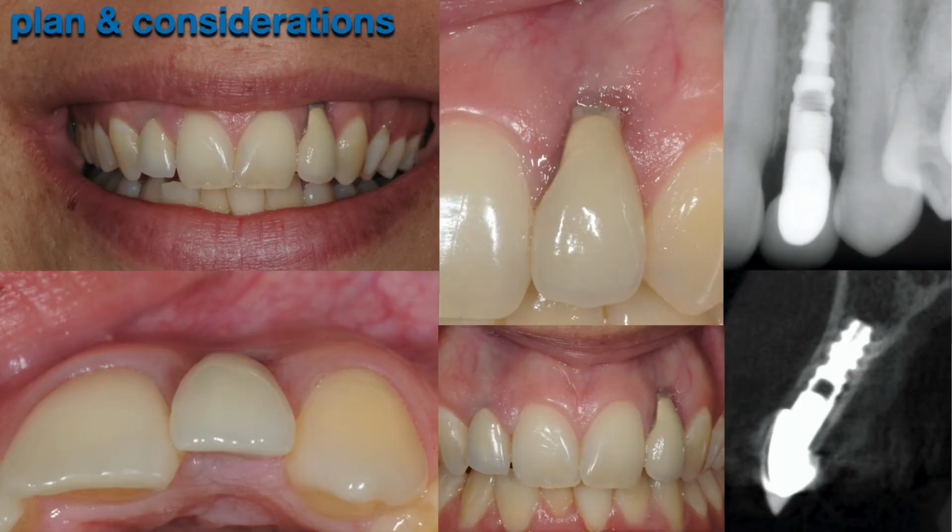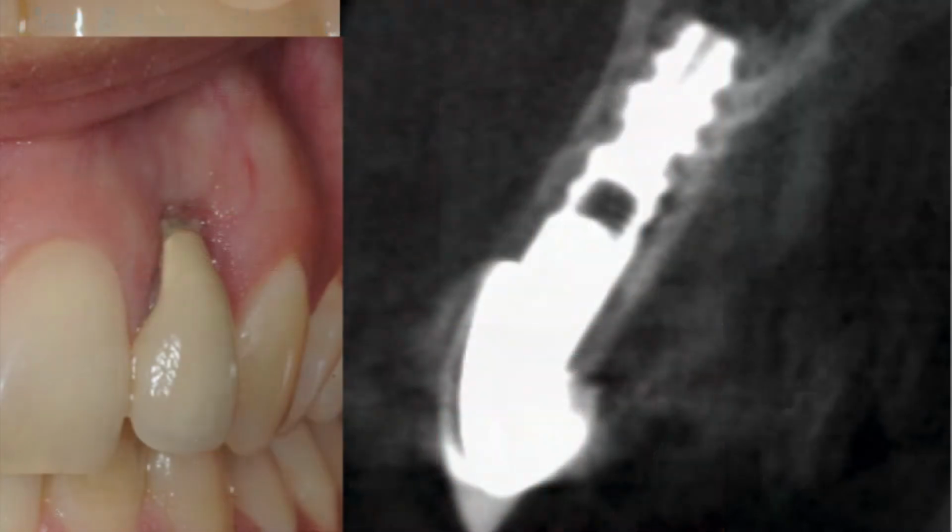But there are a couple of surgical things to note. Surgically, this implant is placed perfectly between the buccal and palatal corridor there. But restoratively, it's not working for me; it's too shallow. But you can see on the CBCT there is really good, adequate palatal bone, an abundance of good bone. And that will determine what our treatment options are going to be.